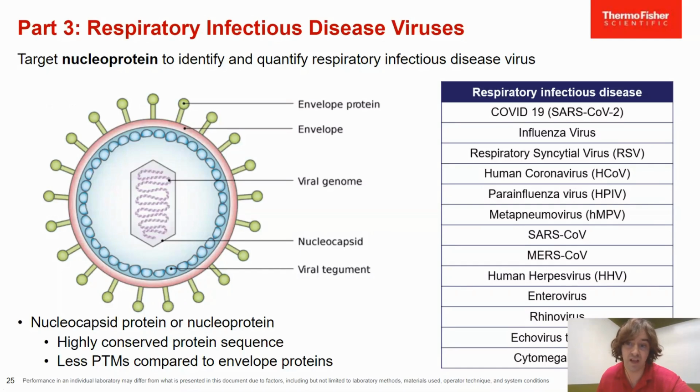Therefore, targeting the nucleocapsid proteins of multiple viruses within one run simultaneously is a workflow that we believe is most likely to provide robust testing methods for a panel. Literature reviews were able to identify a number of unique targets favorable for LC-MS analysis in SARS-CoV-2, influenza A, influenza B, RSV, and human coronavirus, and antibodies were commercially available with specificity towards each of these targets.